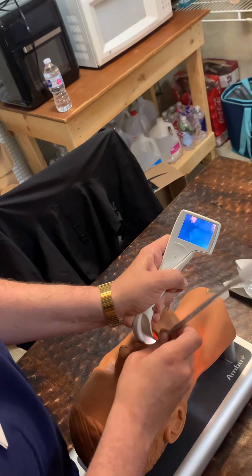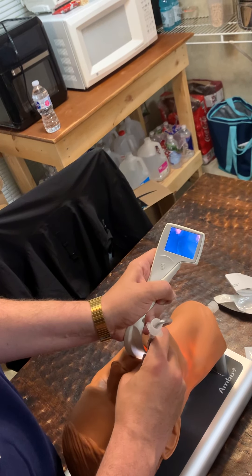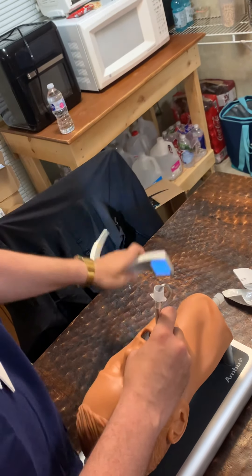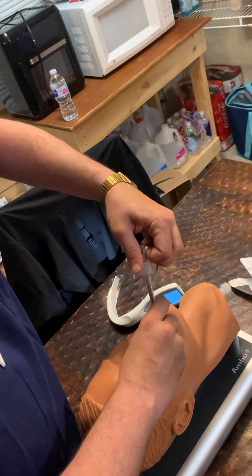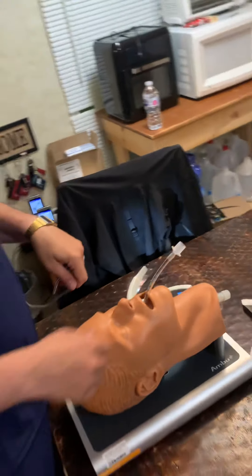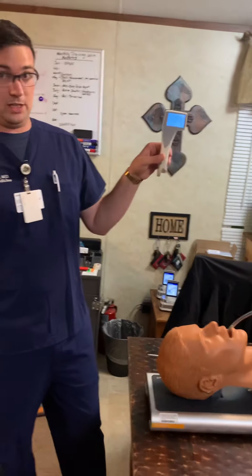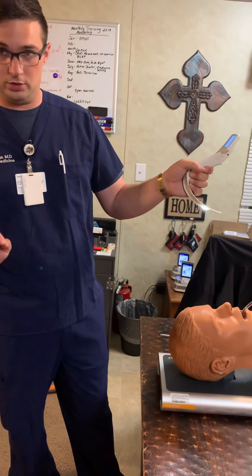And then you see the tube come under your camera view there. And then score — okay, so now that's in. Pull my left hand out, so I'm done with this. In real life, you just throw it out at this point. Pull my stylet, and I can put my tube in as far as I need to. It's very easy to verify ET tube placement with this because you can actually see the cords with the tube go through it.